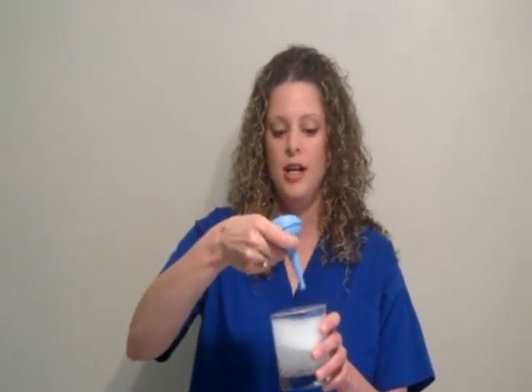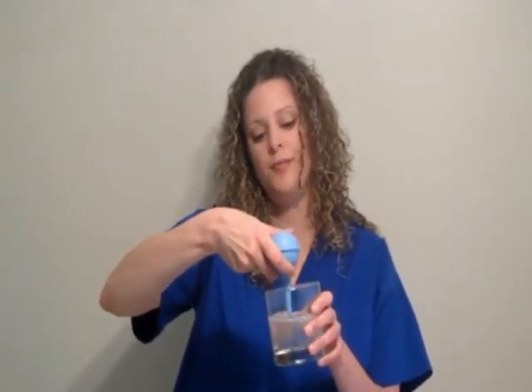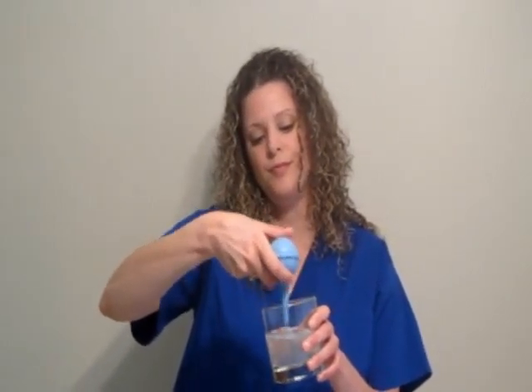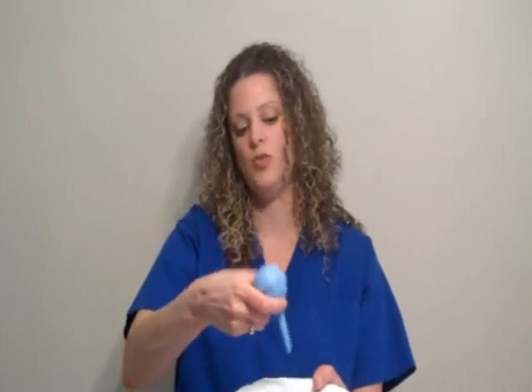So you're just going to take your bulb syringe and suction in the water, suction out, and then you'll want to rinse it with some plain water, get the soap out of there. Okay, and then empty out any excess water onto your paper towel. And that's it. I hope that this video showed you how to safely use your bulb syringe, and just remember to keep it with you.